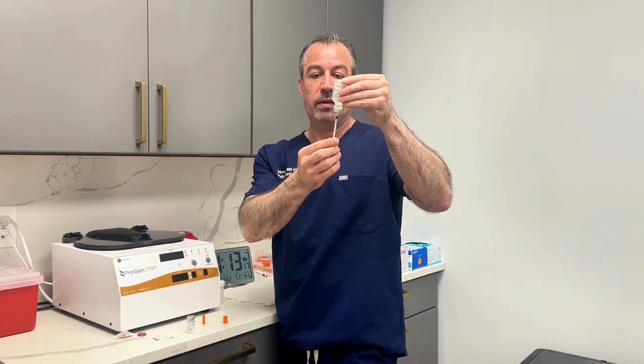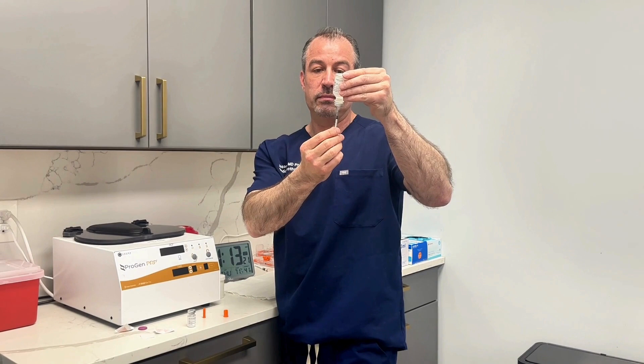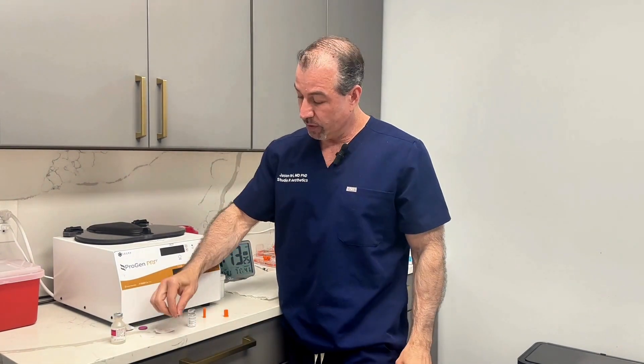You inject the water and then pull back the semaglutide to the 10 spot. Then the needle's ready. I get the needle ready first, put it over to the side because it's sterile, and then I get my belly ready.